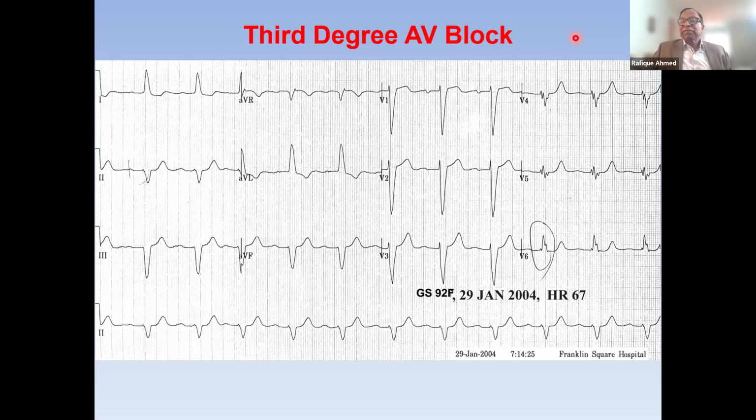Anything else? Sir, we have many patients whose resting ECG shows RBBB. The patient has a history of one or two episodes of syncope or pre-syncope. Other tests are normal, so echo, Holter, everything is normal. Should we do diagnostic EPS in these patients, sir?